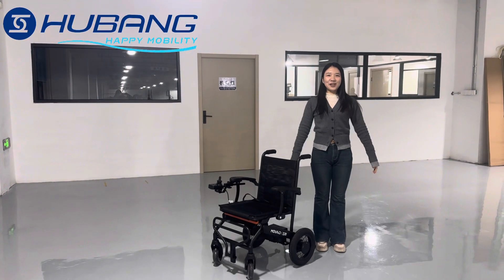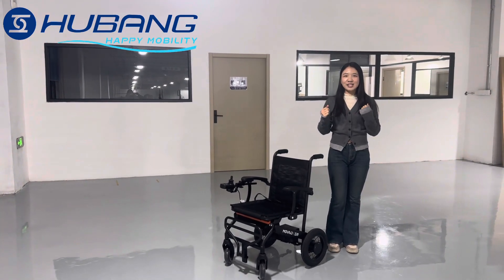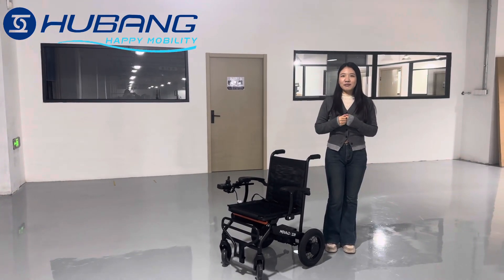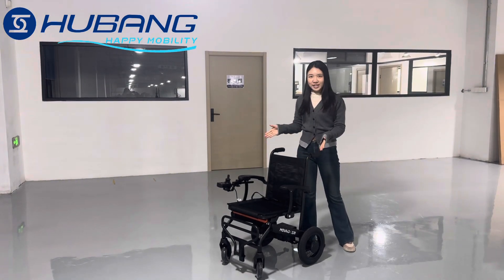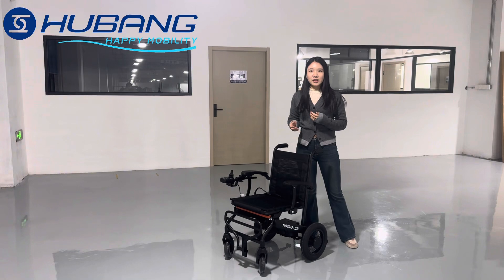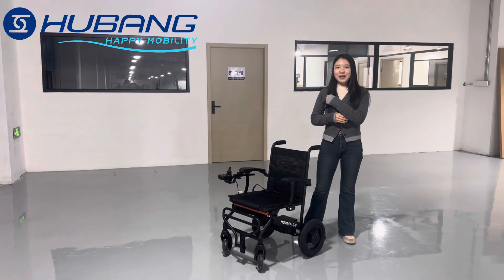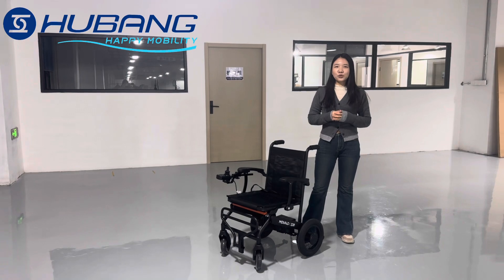Hi there, welcome to HUBAN wheelchair channel. Today I will share with you our latest semi-carbon fiber electric wheelchair, which is upgraded with an improved model. What does that mean for you? Please follow my introduction to know more about its features.